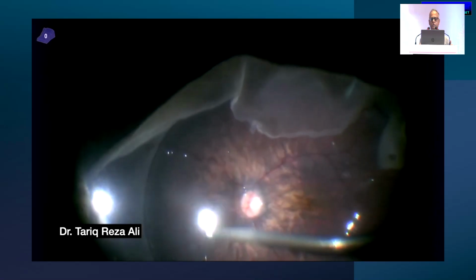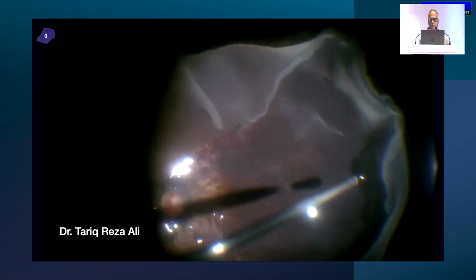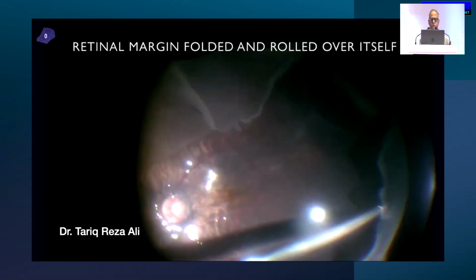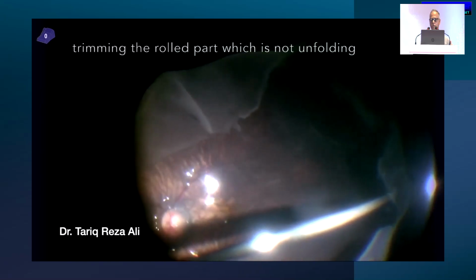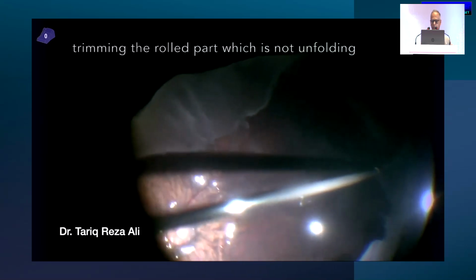Yes, this is the anterior flap. We are removing the vitreous, and then PFCL silicone oil exchange and laser, everything is done, and the retina was attached. Here, as I told, the retinal margin is folded over itself, so we have to trim the rolled part, which is not unfolding.